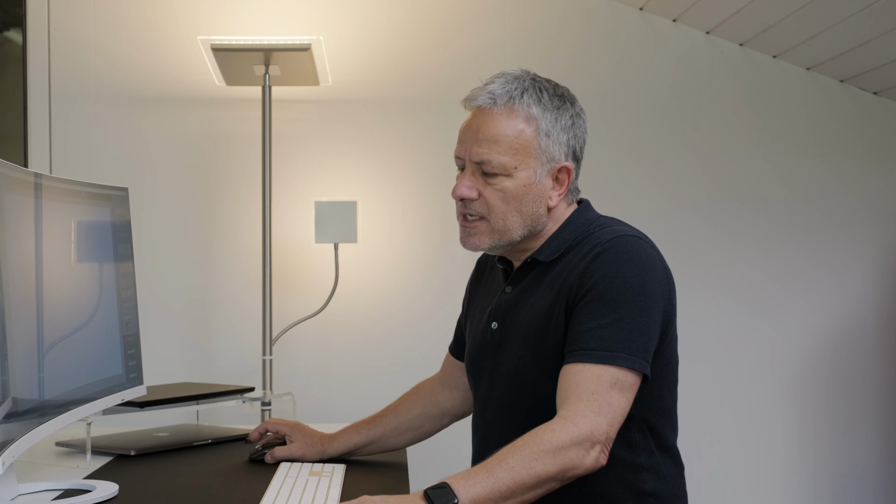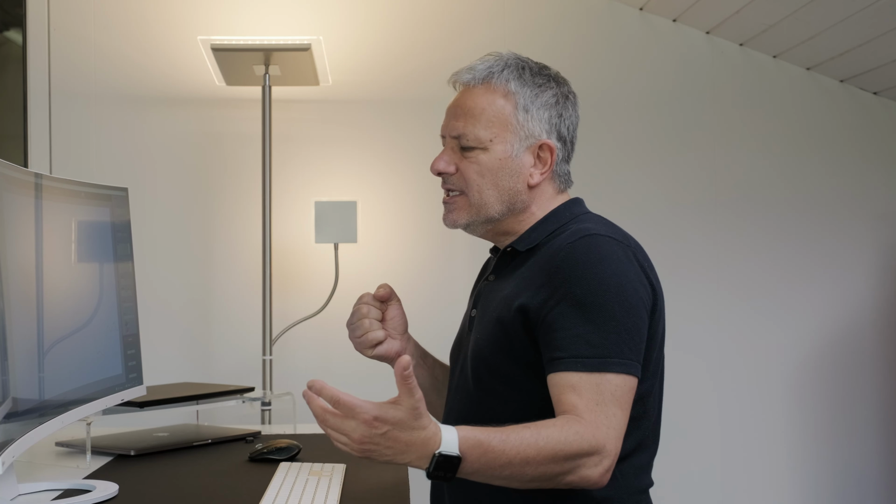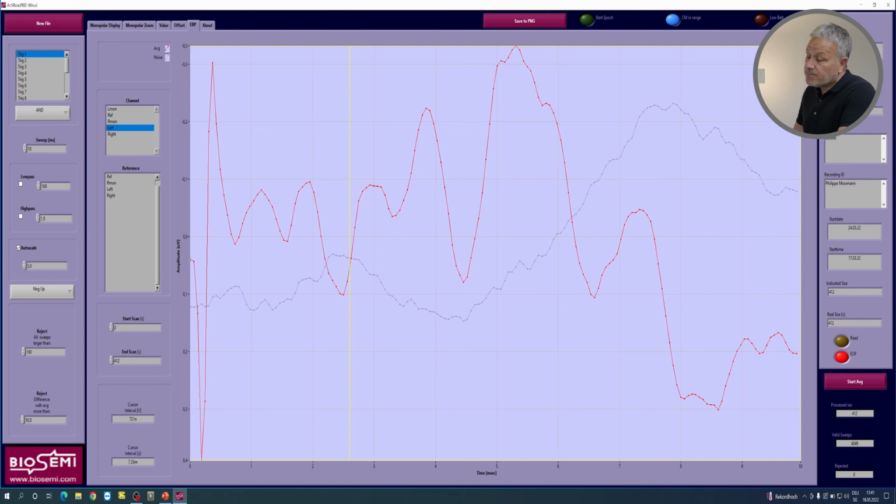And obviously we've set that to rarefaction. Had we set the headphone stimulus to alternation, it would have averaged the stimulus artifact out. We would have probably had a straight line. But we did it to rarefaction. That means it actually pulls the eardrum. And by pulling the eardrum near the electrode, it would give us an actual positive response.